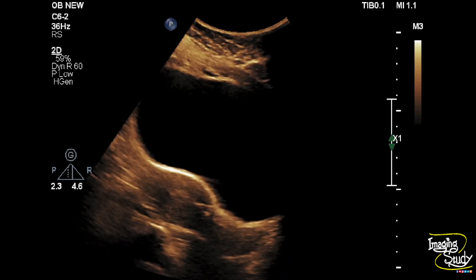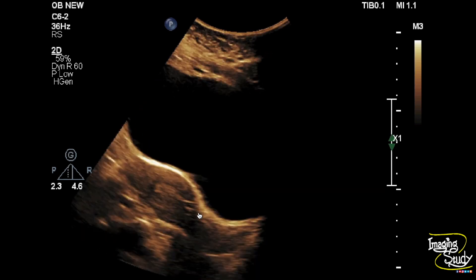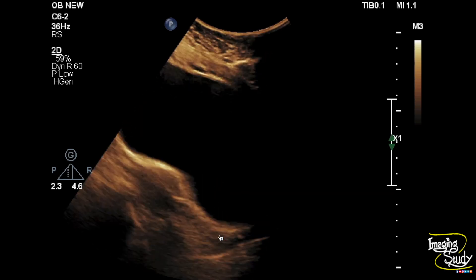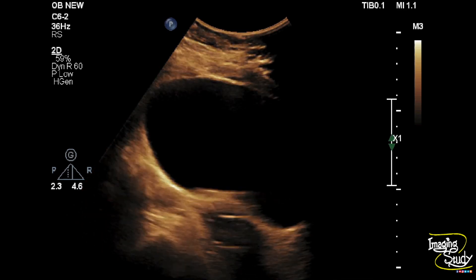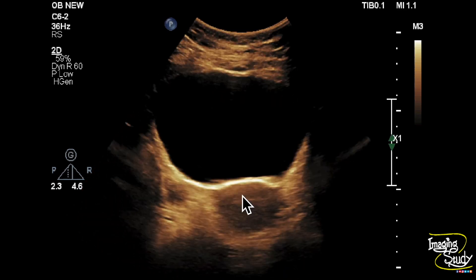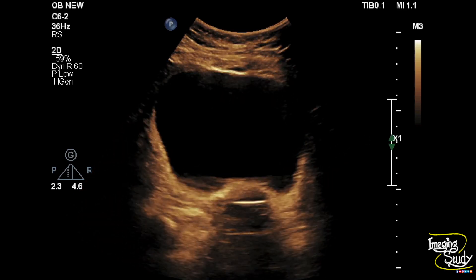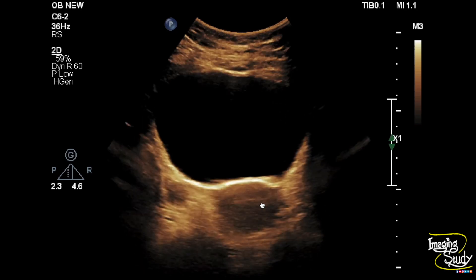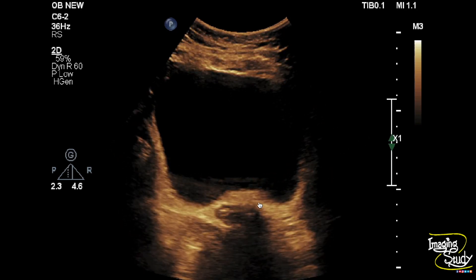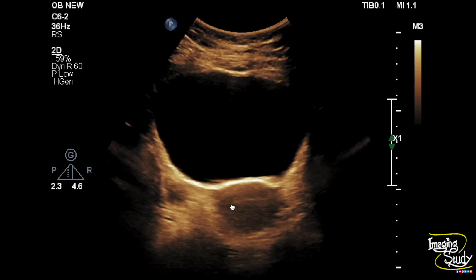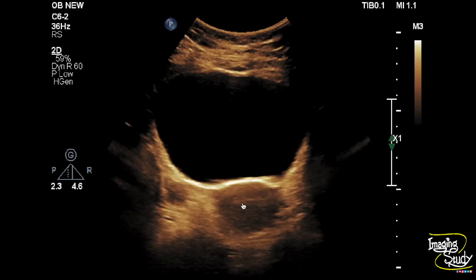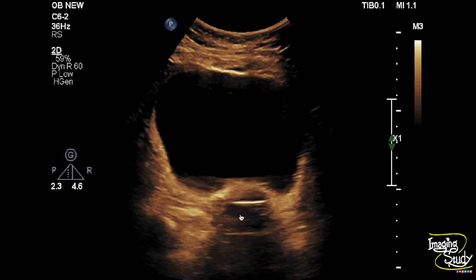Let's see what we have on ultrasound. Here you can see the longitudinal section of the uterus. You can see a hyperechogenic foreign body noted at the cervical cavity. On transverse section, you can see the body of the uterus looks empty, and when we come to the cervical region, you can see the hyperechogenic linear foreign body embedded into the myometrium.